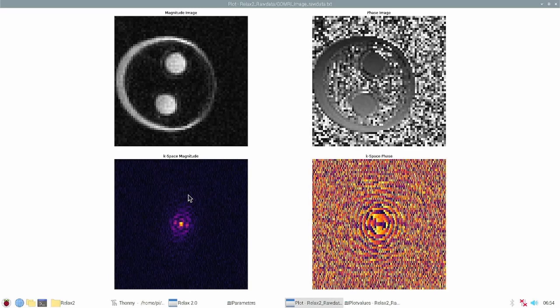In the image viewer you can see the k space magnitude, the k space phase, the magnitude image, and the phase image.